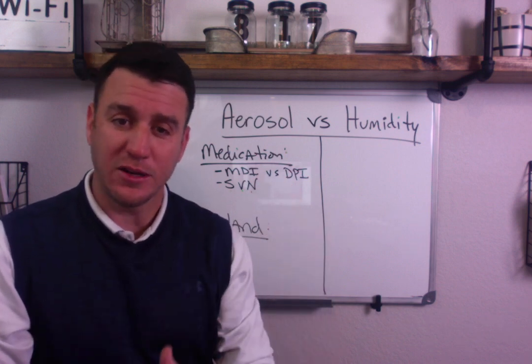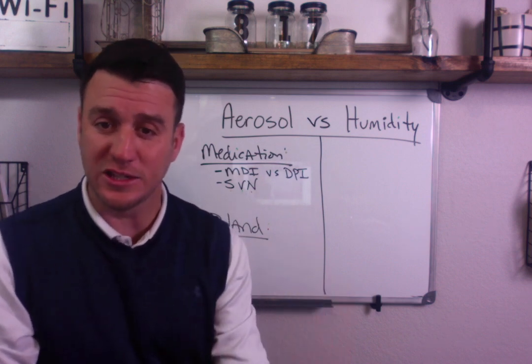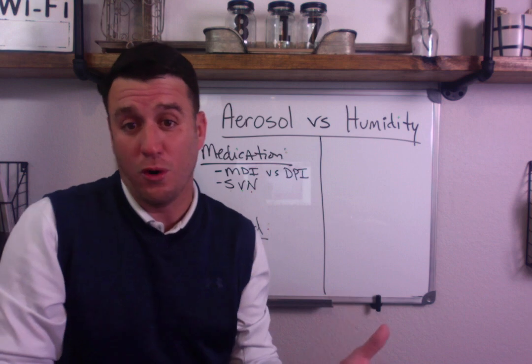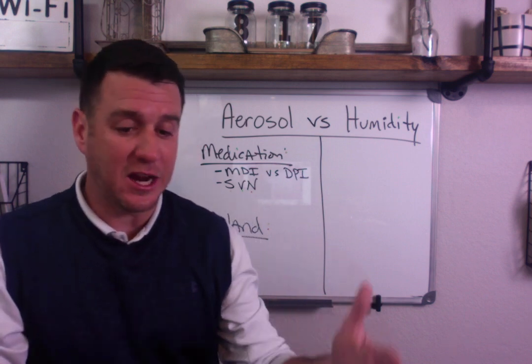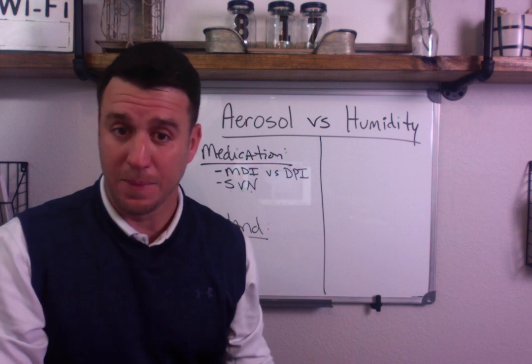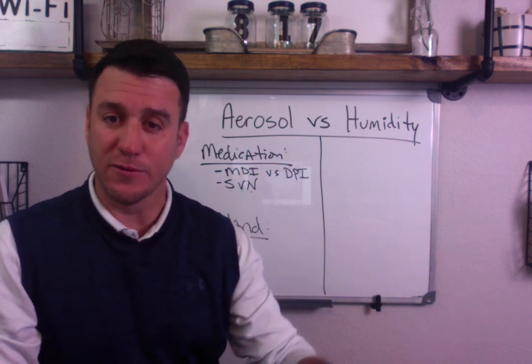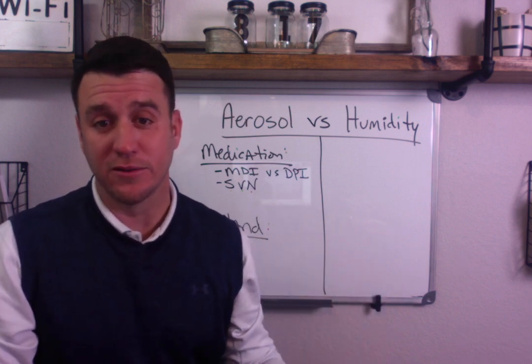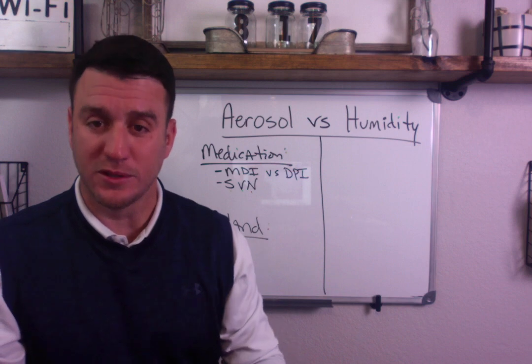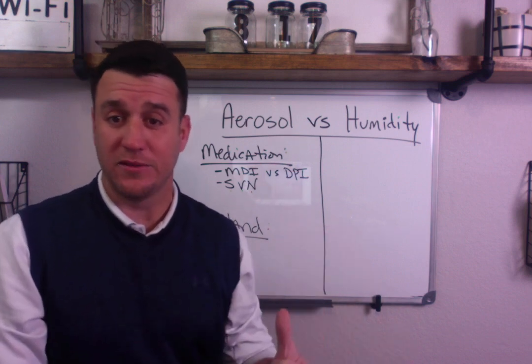Now, what you want to remind your patients to do when you're delivering an SVN, just like with an MDI, is to occasionally do a deep breath with a breath hold. Again, this maximizes deposition in the airways that we want it to be, okay? So that's a small volume nebulizer. If you're ever asked how you would deliver 2.5 milligrams of albuterol aqueous solution to your patient, the answer is probably going to be small volume nebulizer.